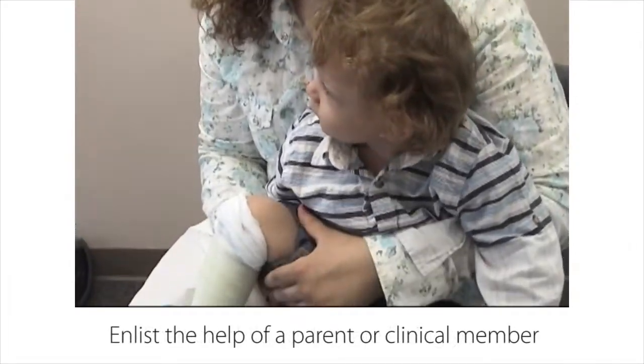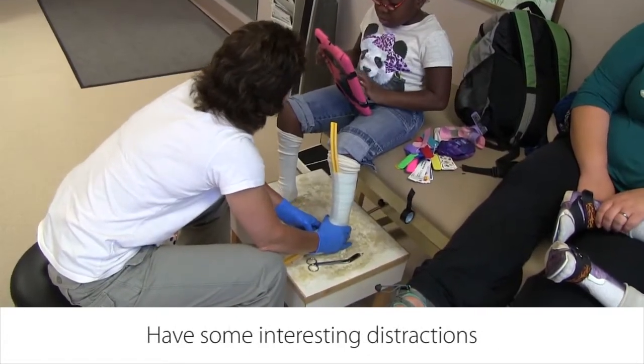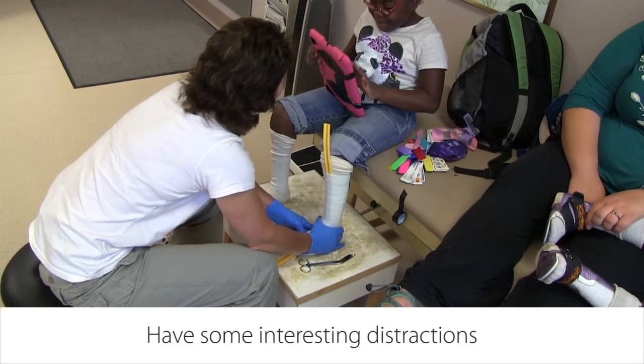Enlist the help of a parent or clinical team member. Have some interesting distractions available like toys, books, or a tablet depending on the age of the child.